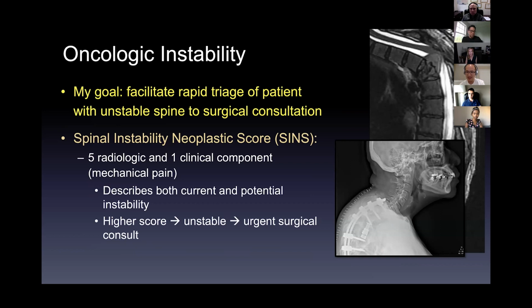And hey, Wendy. Yes. Let me guess, you just biopsied that one too. I already know what it is. I don't even need to biopsy that one.